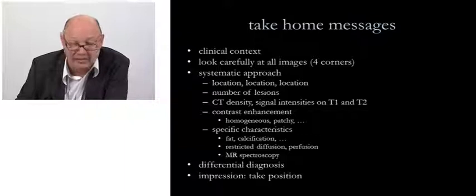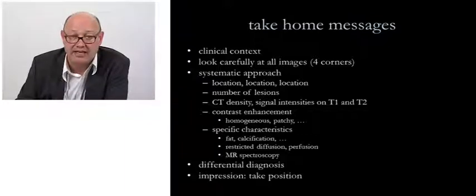And in your impression, I would suggest that you take some position. You will not say it's one of these 50 kinds of lesions that it can be, but you say, I would go for the diagnosis of this kind of tumor.